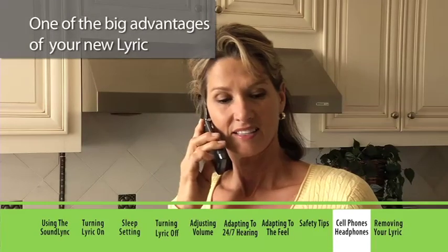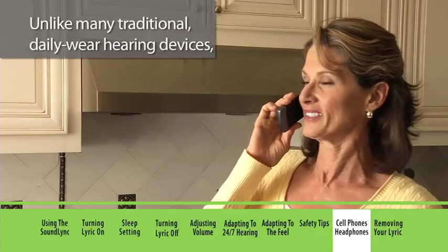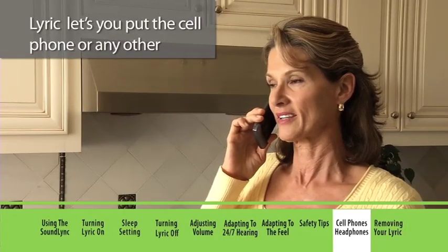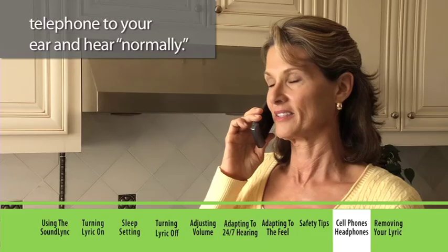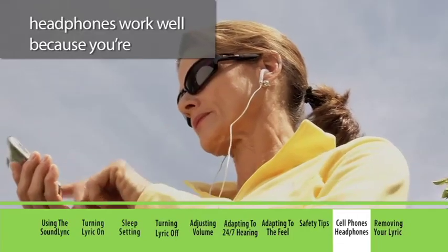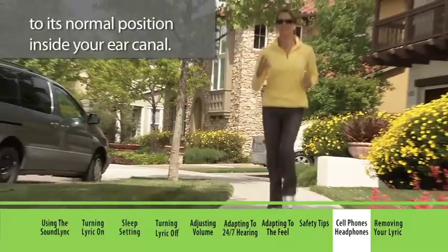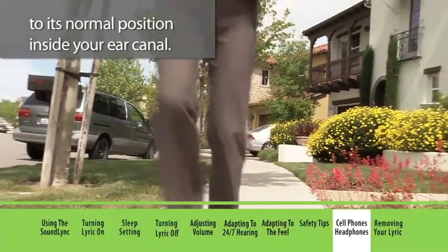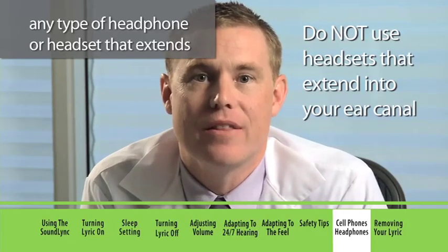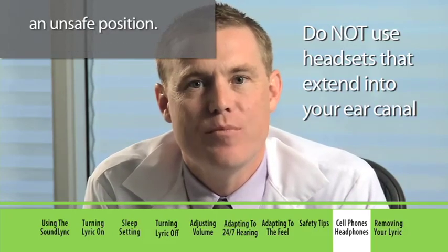One of the big advantages of your new Lyric is the ability to use a cell phone normally. Unlike many traditional daily wear hearing devices, Lyric lets you put the cell phone or any other telephone to your ear and hear normally. For iPod or stereo headphone users, headphones work well because you're receiving and transmitting sound as close as possible to its normal position inside your ear canal. However, do not use any type of headphone or headset that extends into your ear canal, as you may push your Lyric into an unsafe position.